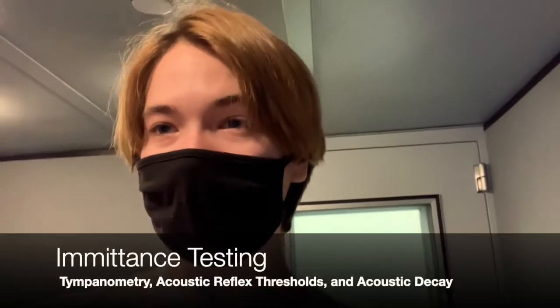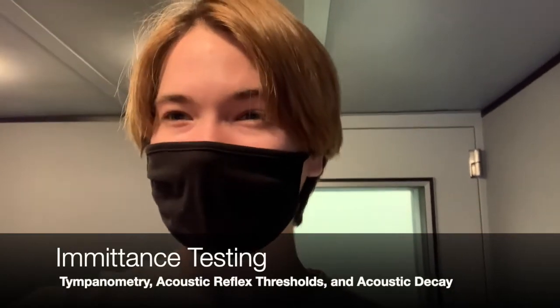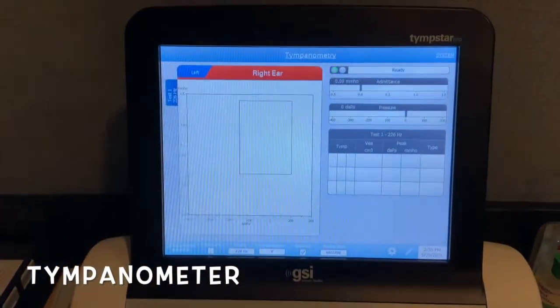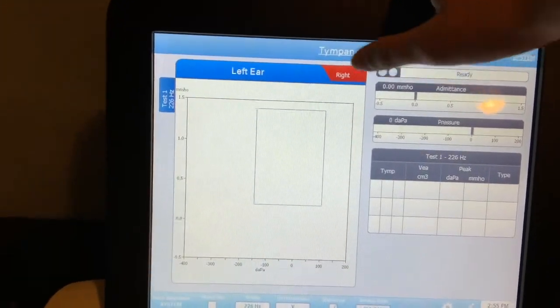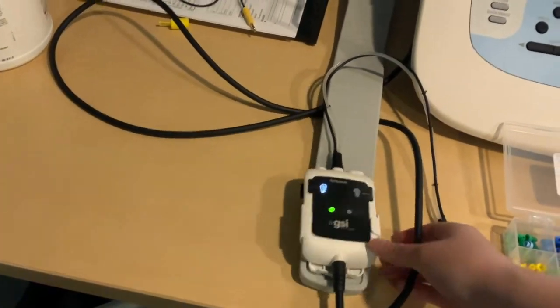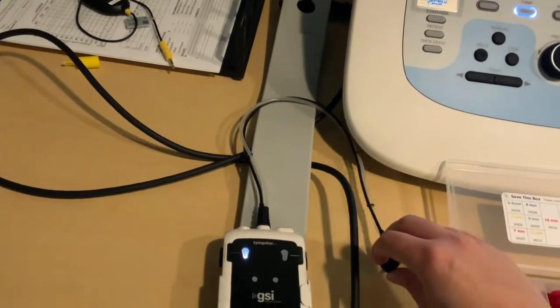So I'm going to show you the admittance bridge and the different types of probes that you can put inside the ear for tympanometry and acoustic reflex testing. All right, here we have the tympanometer. This is showing us the right ear and the left ear, and you can switch between the two depending on which ear you're measuring in. This is going to go over the client's shoulder. Here is where we'll attach the probe, and this is where the microphone goes into the client's ear.